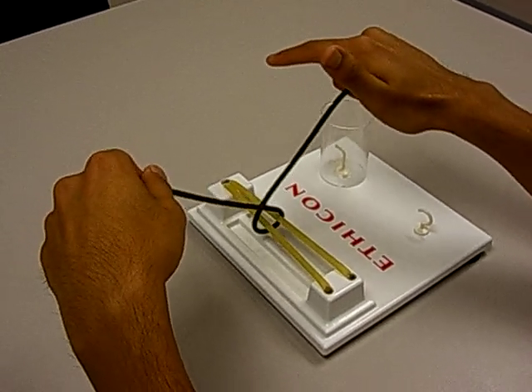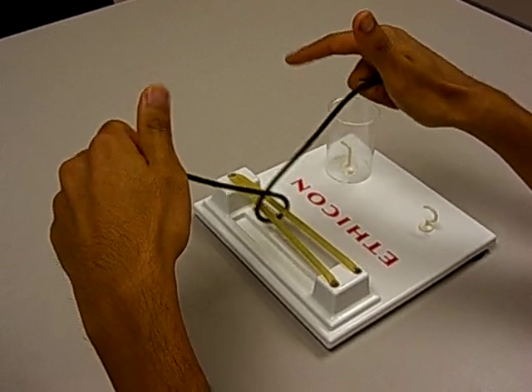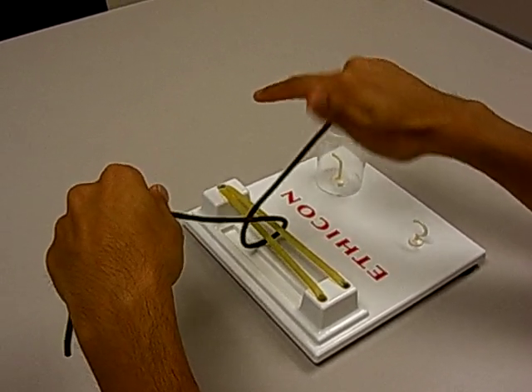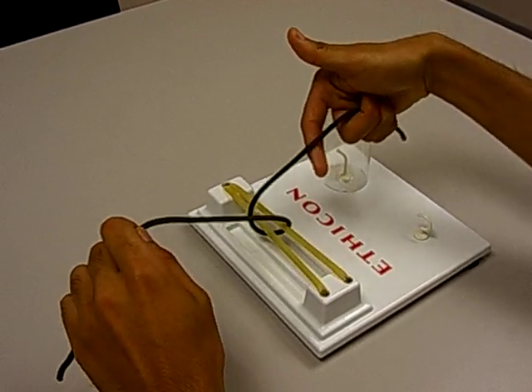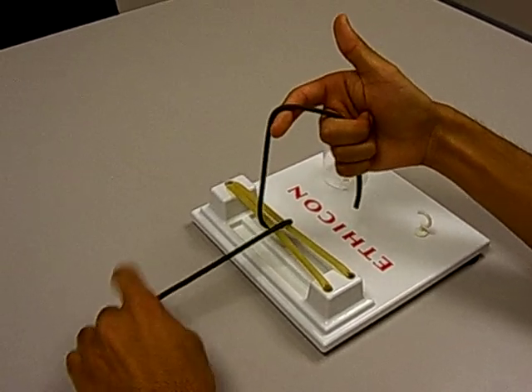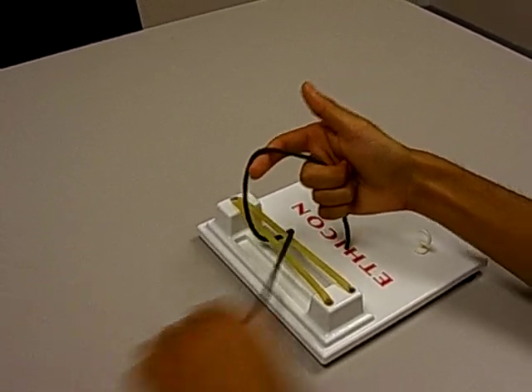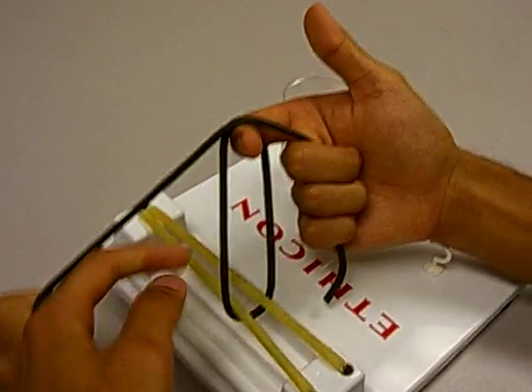A good thing to remind yourself of what we're trying to do: think to yourself — loop, connect, push, pull — and that'll make a lot more sense as we go on. Because this is the first throw, you want to take your index finger a little bit underneath the string on your right side like so, and you can see right here you have half of a loop. Now you want to take the string in your left hand to complete that loop.